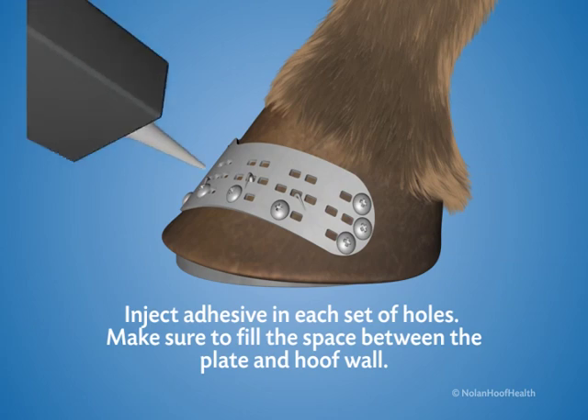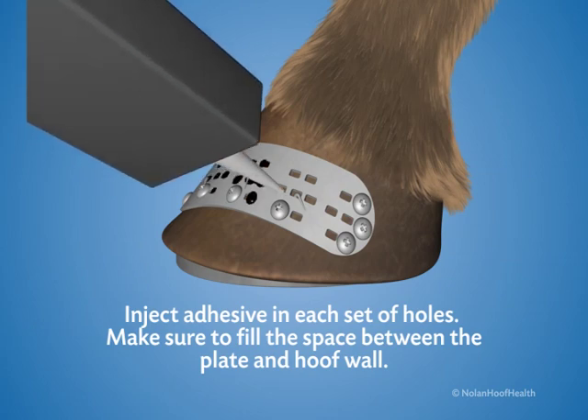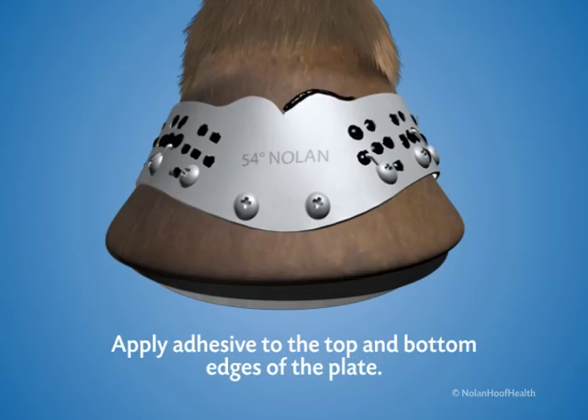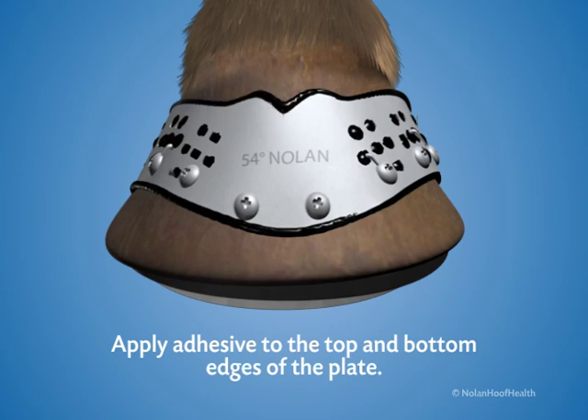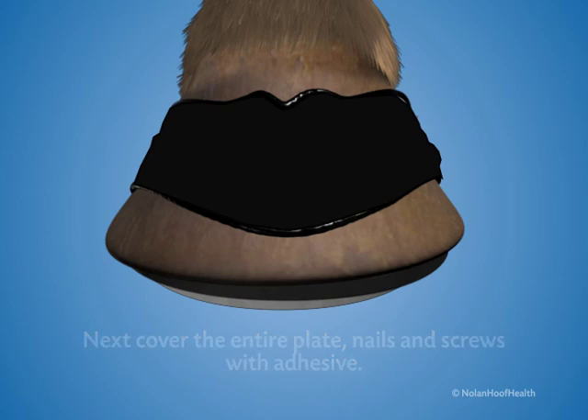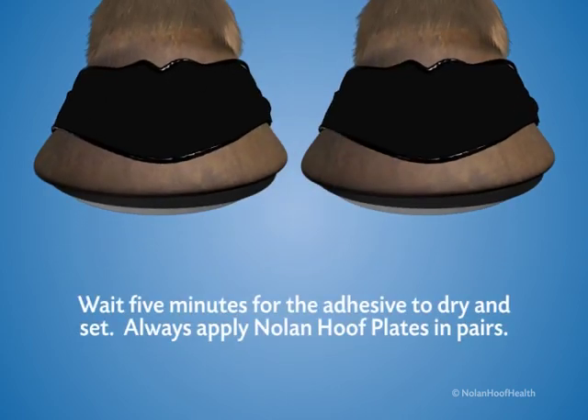Inject adhesive in each set of holes. Make sure to fill the space between the plate and the hoof wall. Apply adhesive to the top and bottom edges of the plate to keep dirt and debris from getting behind the plate. Next, cover the entire plate, nails and screws with adhesive. Wait five minutes for the adhesive to dry and set. Always apply Nolan hoof plates in pairs.